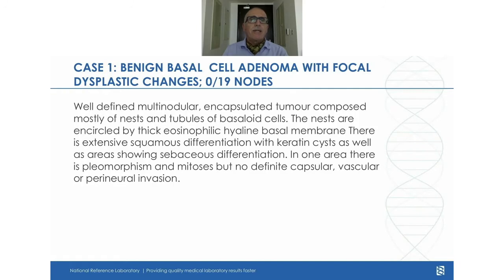And the lesion was actually benign. The nodes were all intact, and the patient went on and happily lived the rest of her life. So this wasn't a malignancy, and it was entirely accepted to suggest this was a neoplasm because of the monomorphism. And in the differential, you might want to discuss whether it's a basaloid lesion, basal cell adenoma, basal cell tumor, and ruling out adenoid cystic or making that less likely.